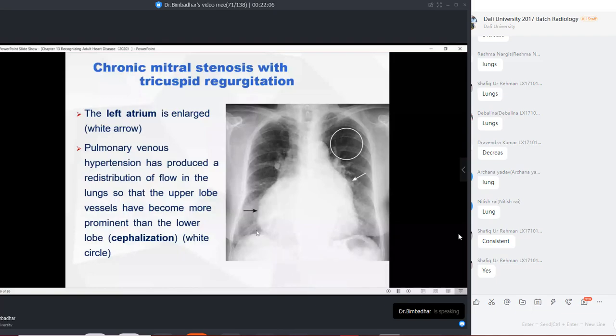I am going to look if there is acuity of the cardiophrenic angles. And you see here, there is a silhouette by a homogeneous hyperdensity of the heart that is overlapping or obscuring the shadow of the lower lung fields. Yes or no? That is how I describe this X-ray.